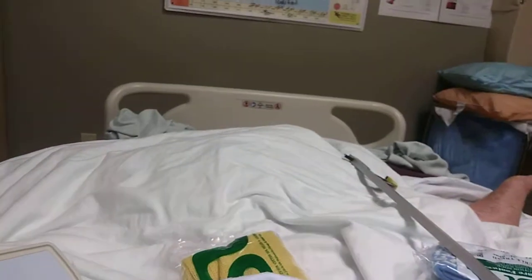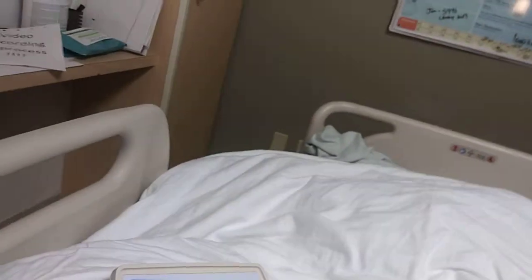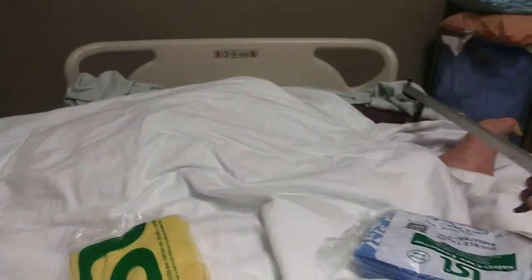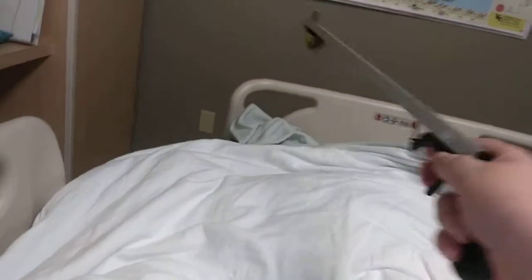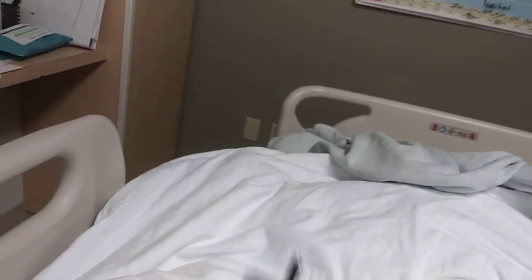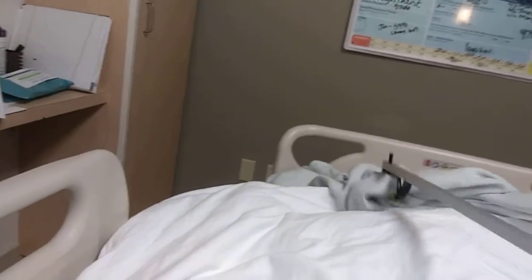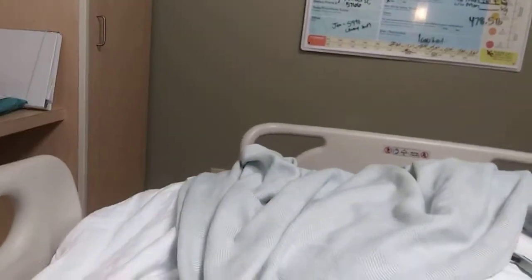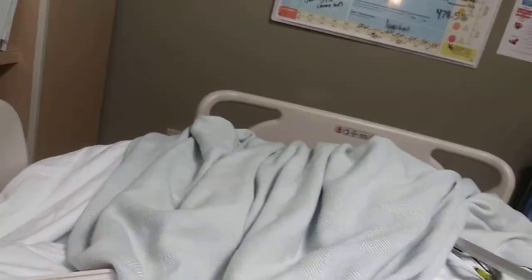Okay, so also, if I wanted to, I could go like this, and I don't want these to fall, but let me see what I can do here. Oh, this is hard. Okay, so if I wanted to, let's say, this blanket down here, instead of calling nurses, I just go like this, and pull it up here, and whoop. Look at that, it got stuck all by itself. There it goes. Because I put more pressure on it than I can hold. And anyways, this just kind of shows that I can pull it up myself and then grab it the rest of the way. So that way I don't have to go, nurse, I can't reach my blanket, can you help me? Like that. Okay, so that's that.